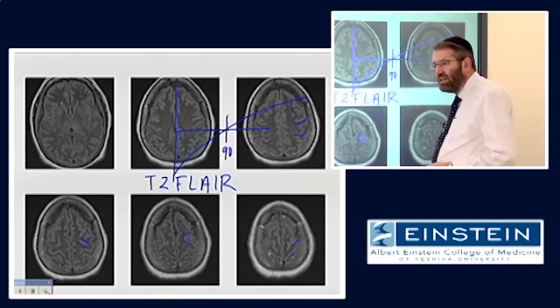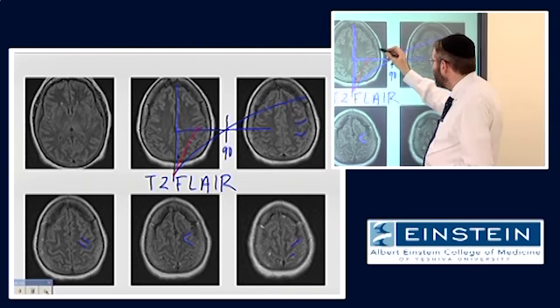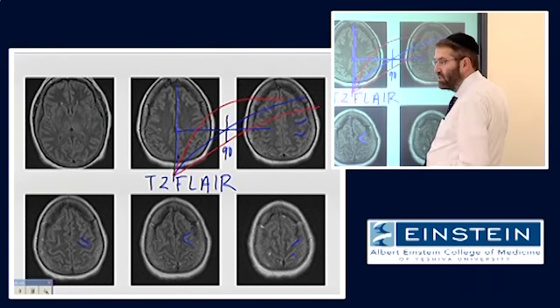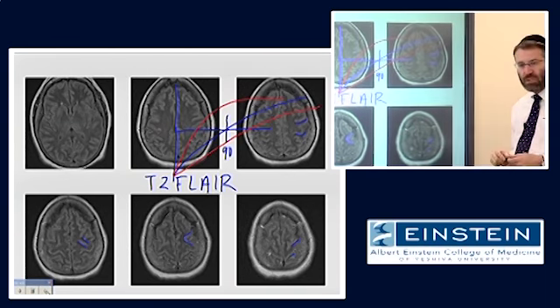If there's something in the cerebrospinal fluid, that can alter the T1. And if the T1 of CSF looks like this, or looks like this, when we give our 90-degree RF pulse, we actually have a substantial amount of longitudinal magnetization.